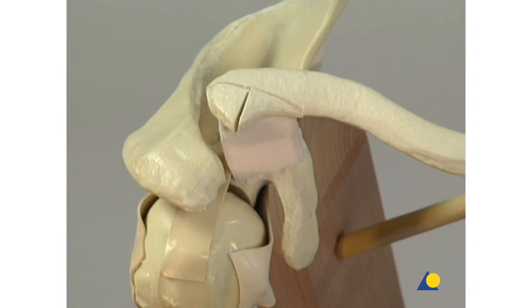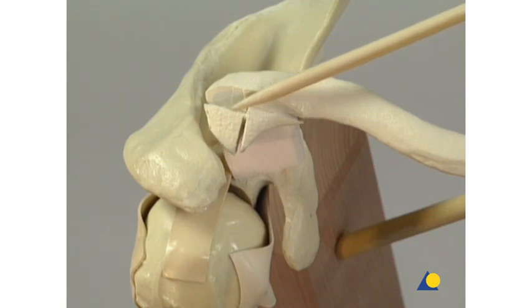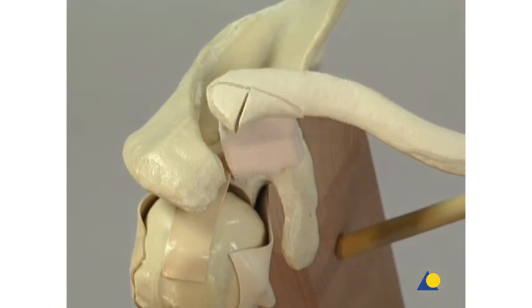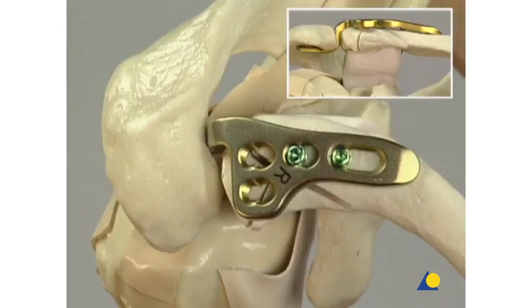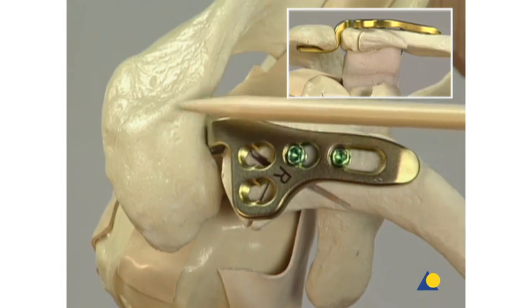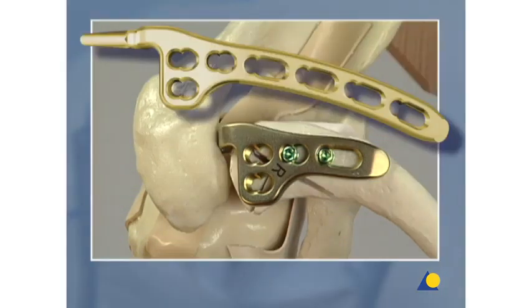In cases of small lateral or communuted fragments, internal fixation of each fragment is neither possible nor necessary. The hook of the plate helps to reduce the lateral clavicle, so it's not necessary to reduce the fragments individually. Temporary fixation of the fragments can be done with clamps or a K wire. It is important that the plate and plate hook are positioned correctly. In the case of a lateral clavicle fracture, the plate must be sufficiently long to ensure appropriate fixation on the medial side of the fracture. However, in most cases of a fracture situation where a seven-hole plate is required, adaptation of the plate by twisting it is necessary for the most medial screws to engage properly.